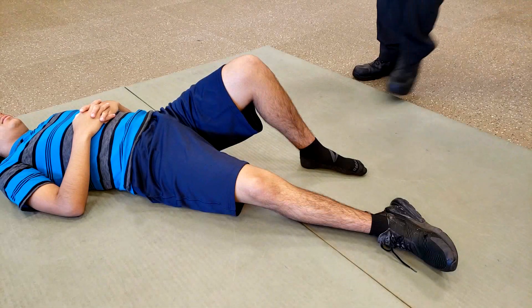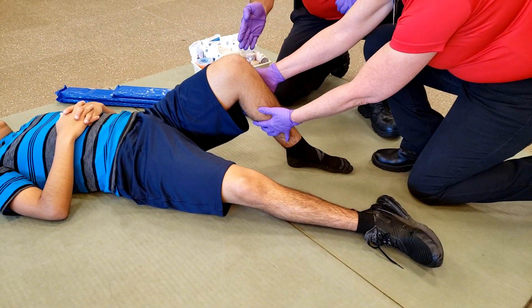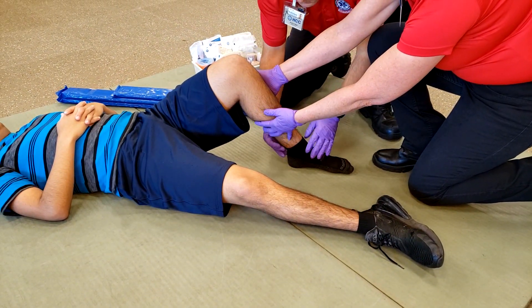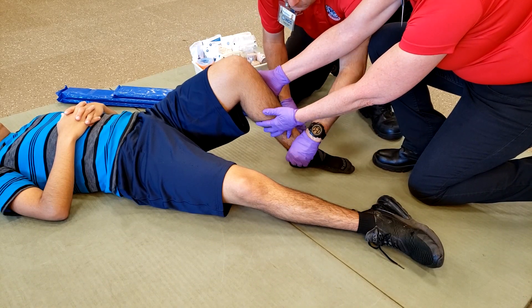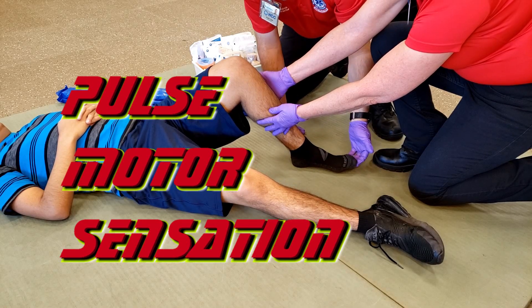Another method to splint an injured knee can be done by using long boards. Long boards or Sam Splints can be decided upon based on the working area available as well as patient comfort. Check pulse, motor, and sensation distal to the injury.